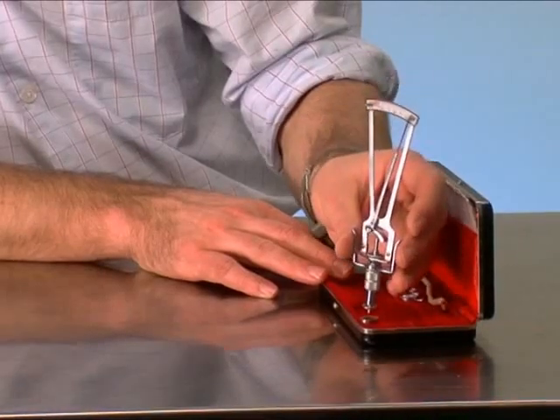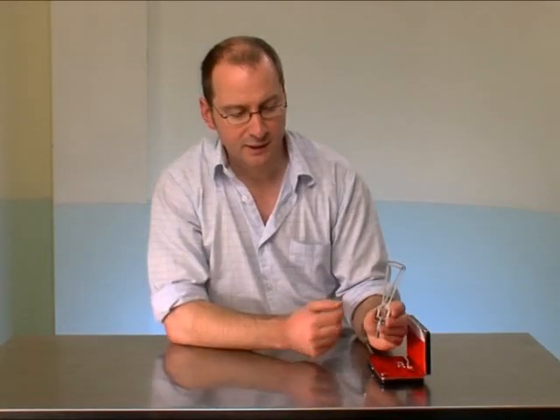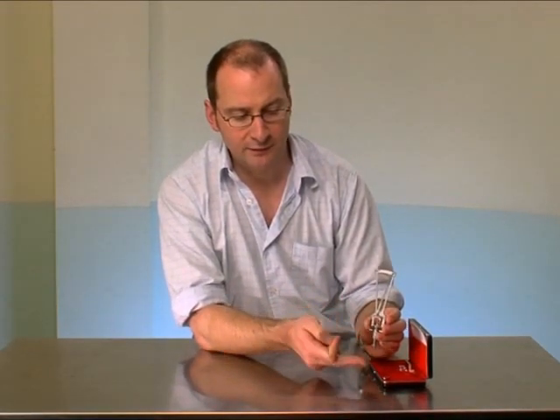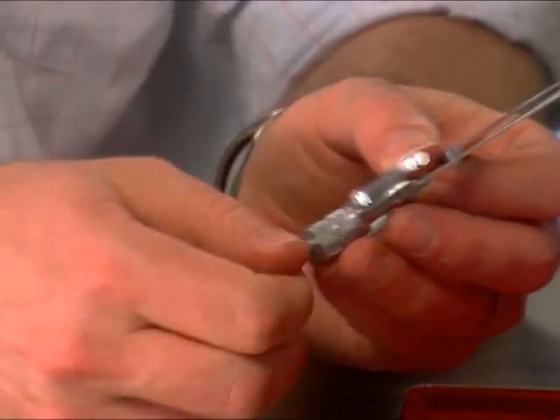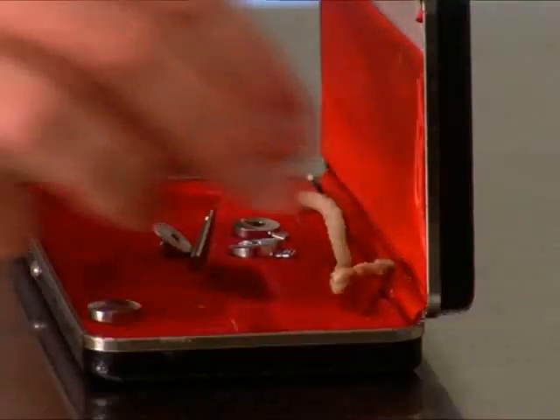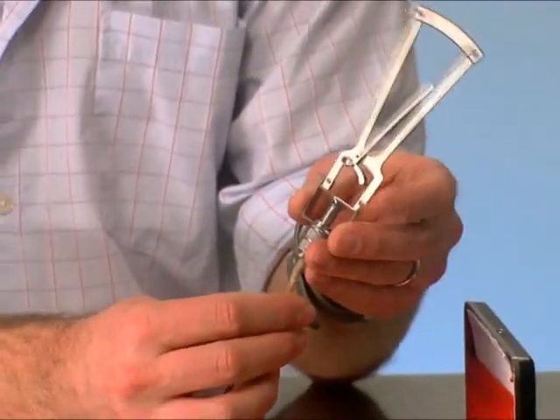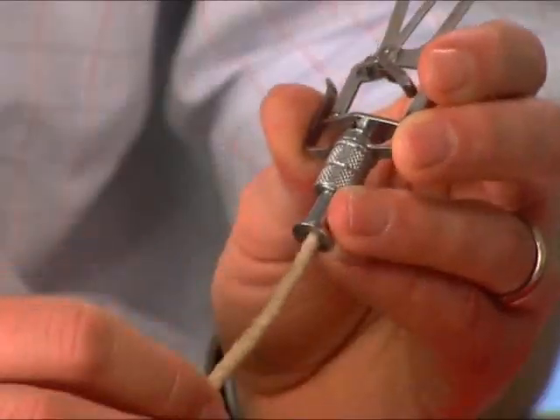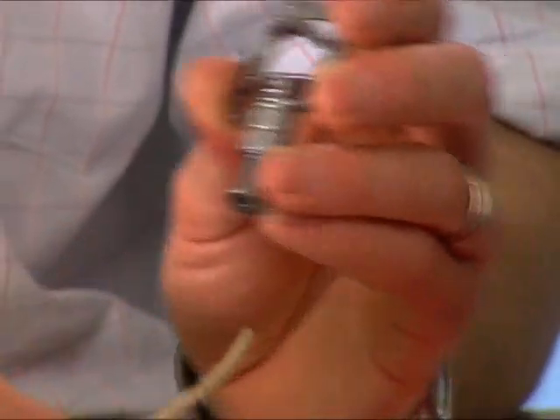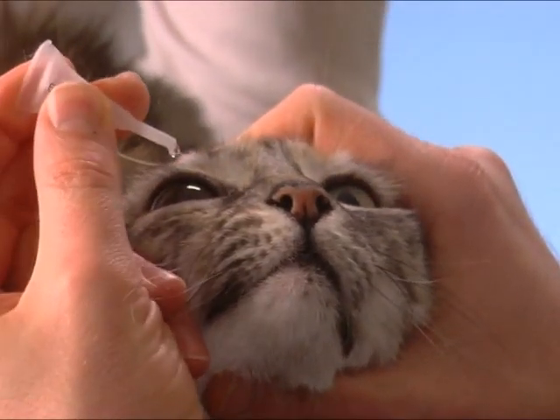If the needle is not moving smoothly to 0, it could mean that there's interference or debris where the plunger is running, and you will need to take the instrument apart and clean it. The same should be applied at the conclusion of using the instrument, so that it is maintained in a good clean state for future use. Before the tonometer is used, local anaesthetic is applied to the cornea.